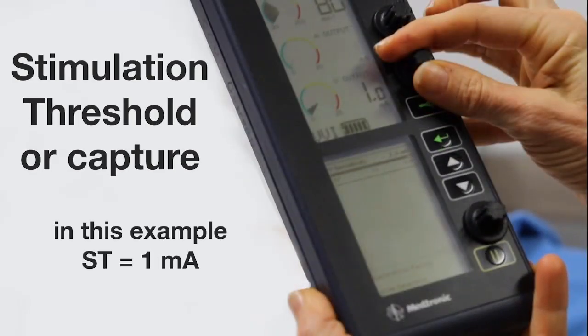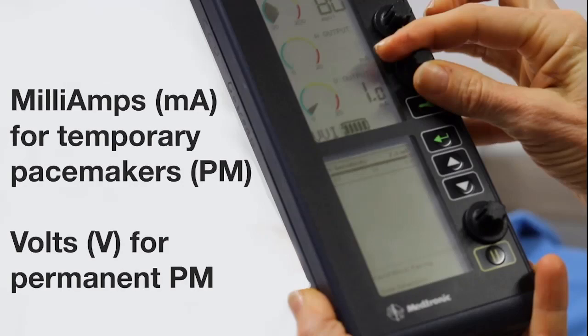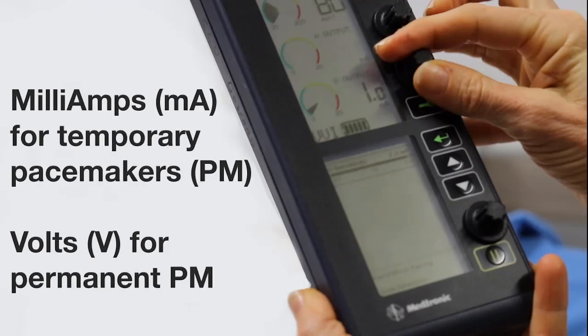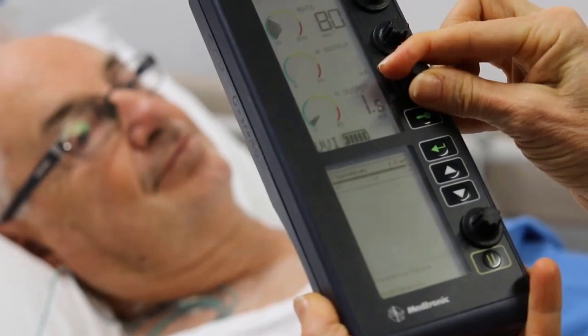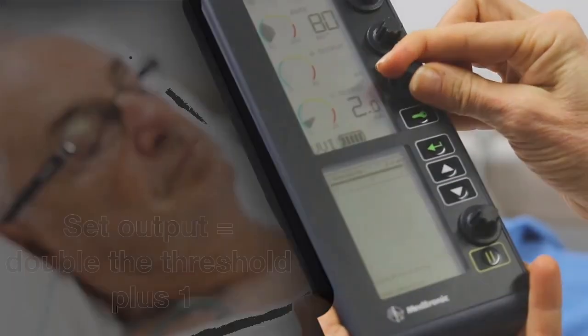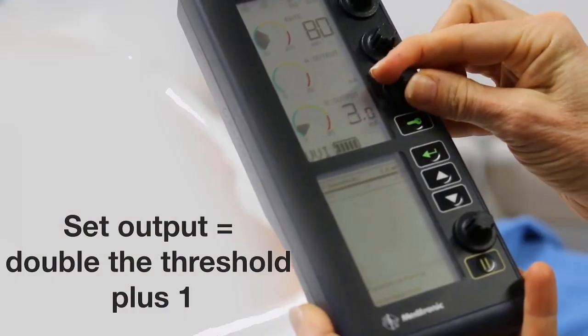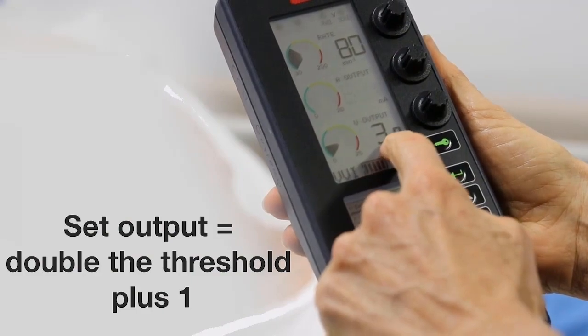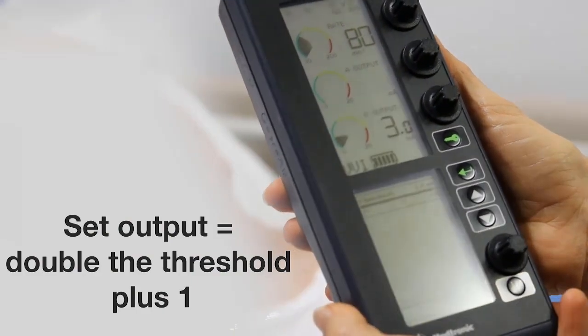It is usually measured in milliamps for temporary pacemakers and volts for permanent pacemakers. You then set the output at double the threshold and add 1 as a safety margin to prevent loss of capture.